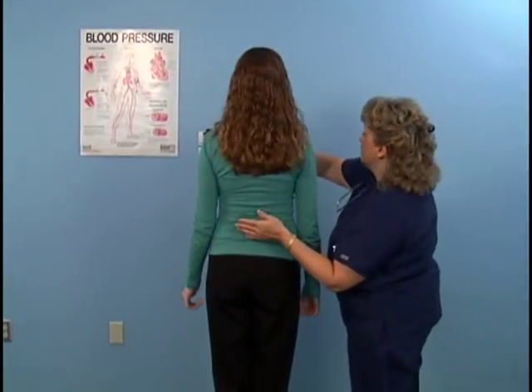Measure the patient's weight and height. Make sure all values are accurately documented. An important role of the medical assistant is to instruct and prepare the patient for the examination. Ask her if she needs to empty the bladder before the examination. An empty bladder makes the examination easier and more comfortable for the patient.